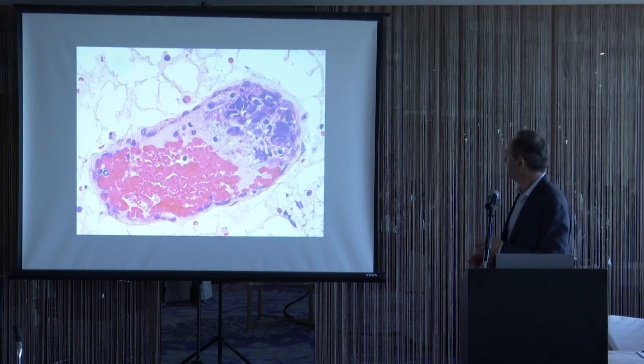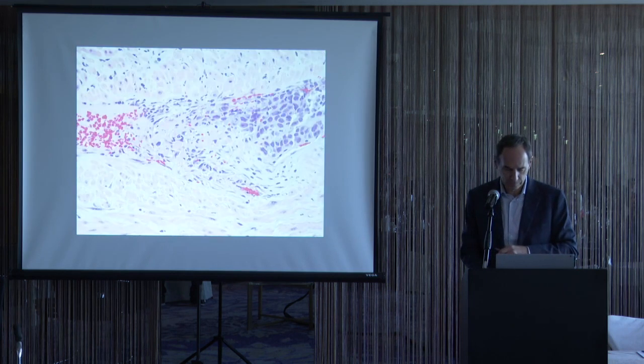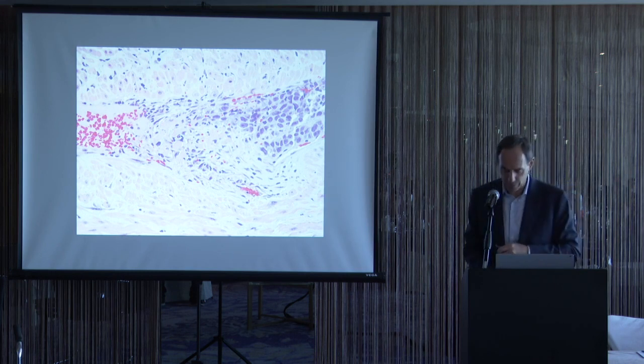Higher power of a different case of embryonal carcinoma, the association of this fibrin, this pink amorphous material, tells me that this has, again, been there for a while and that this is real, not just artifactual. Another case of embryonal carcinoma, which is undergoing fibrin and organization of the fibrin, so a real tumor thrombus.